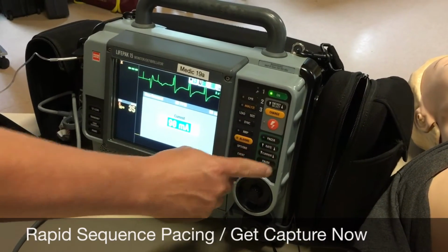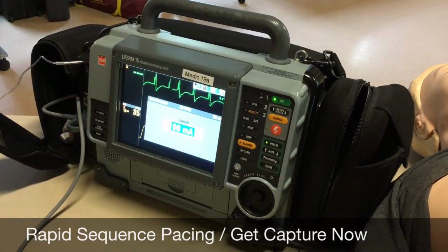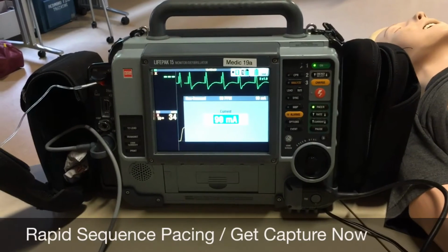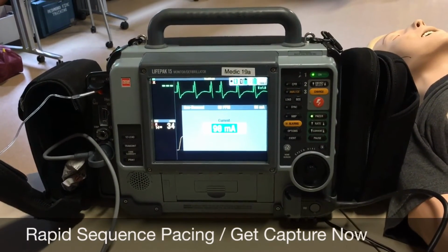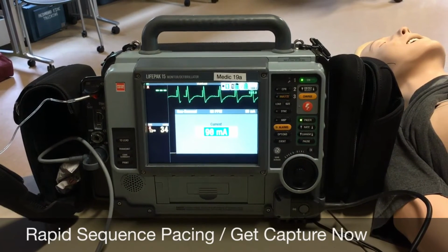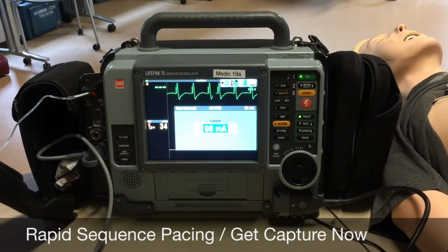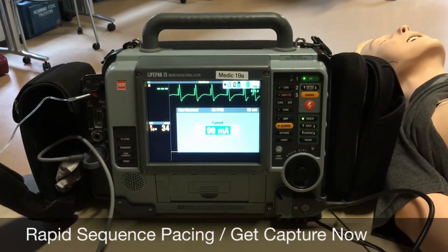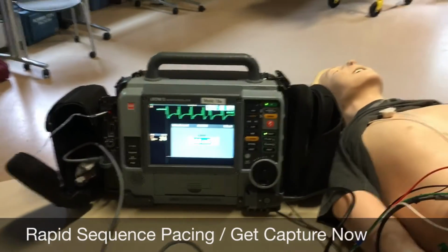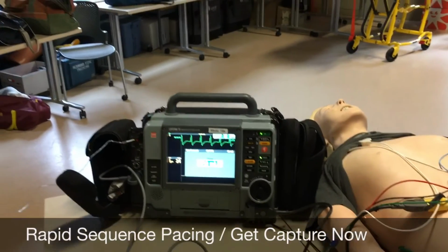And then we're going to go one set above that location so that we can hold capture. So what I accomplished there was immediate pacer capture of this patient so that we didn't have to do CPR, and then I came and backed it back down to where I lost it and then bumped it back up 10%.